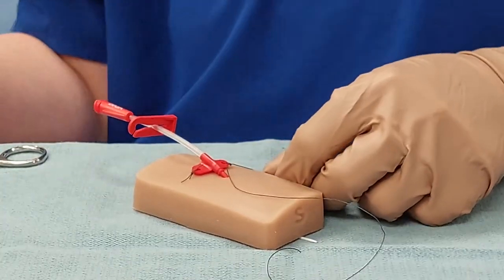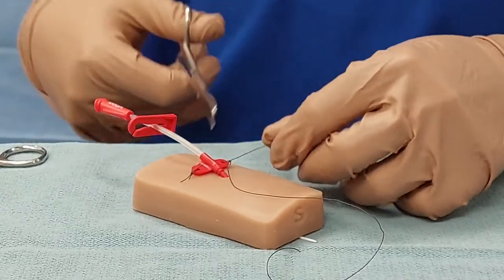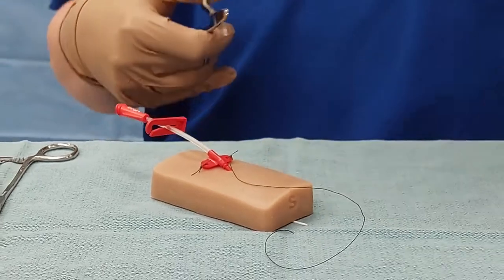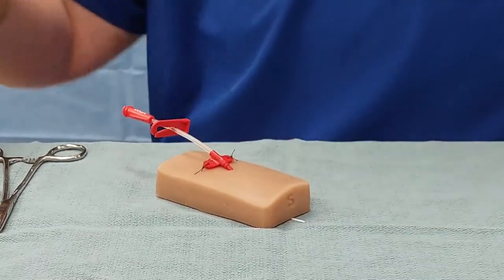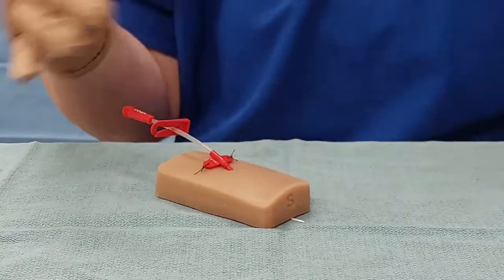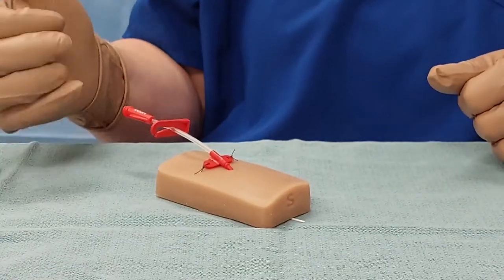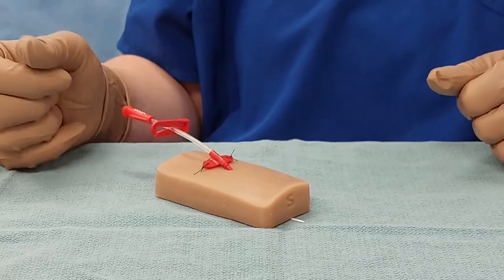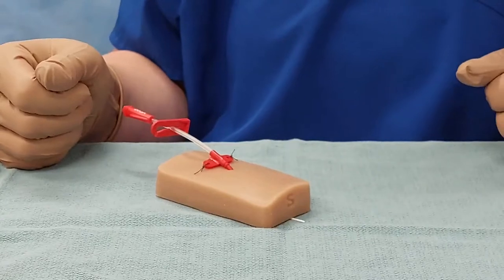Check to make sure that you don't have any holes where you can see light through them. Check to make sure that your skin integrity is good. Cut half a centimeter on the tails. At this point, you're going to want to clean up the insertion site before you put your dressing on. You can use the 0.5% chlorhexidine swab, an alcohol swab, or whatever you have to keep it sterile.